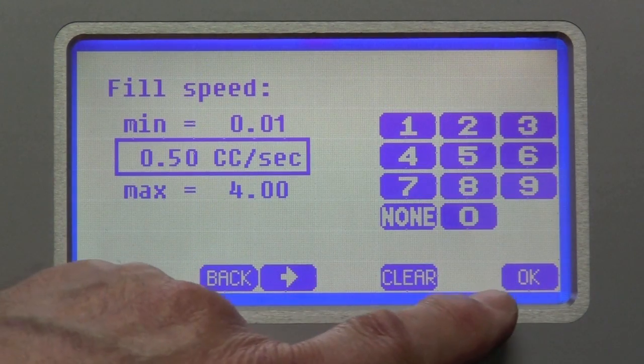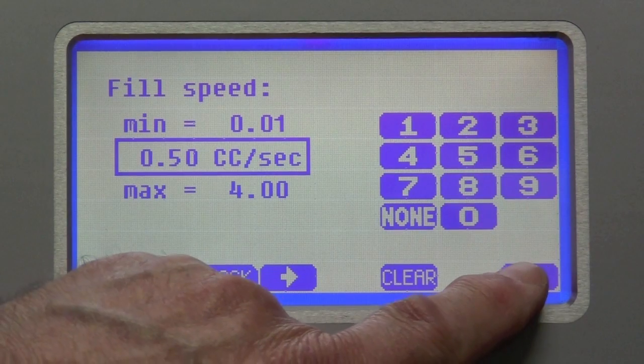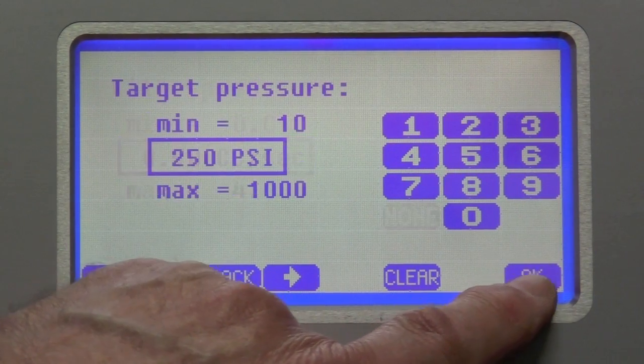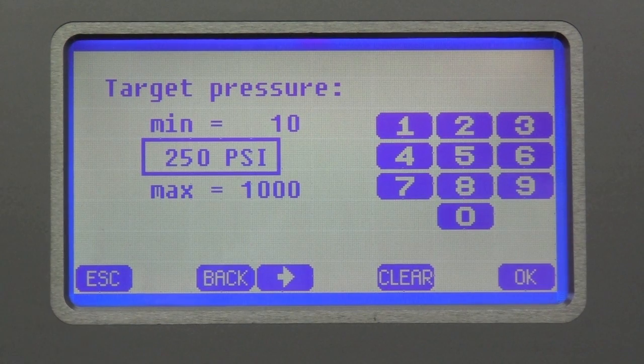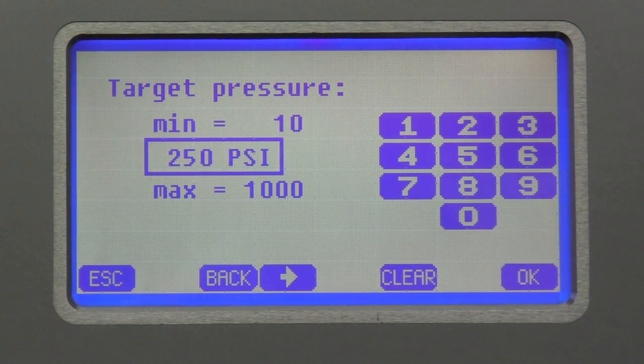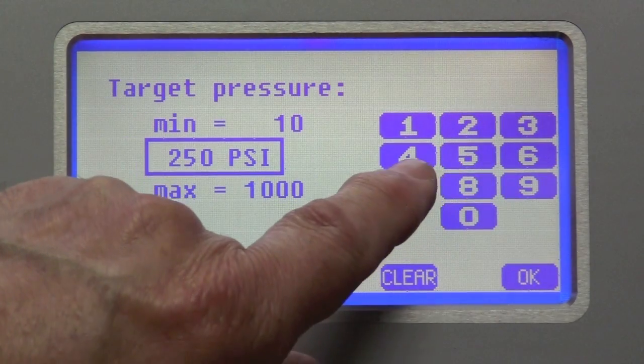Fill, this is where the product is filled prior to the beginning of the test. And you set the fill rate. Here the target pressure. In this case, we could set it as high as the limit of the machine. In this case, it's a thousand psi. I'm going to set it for 750.